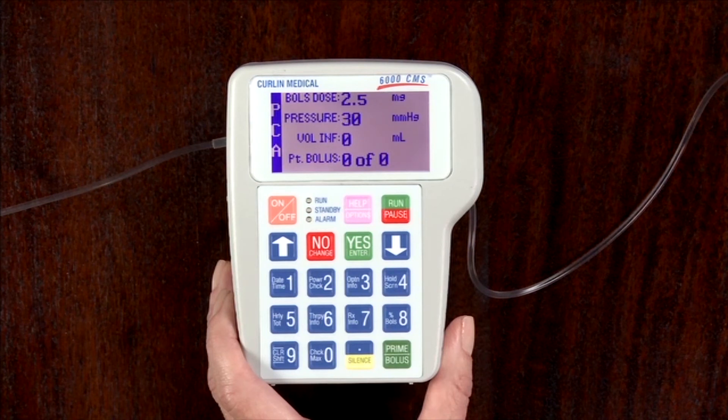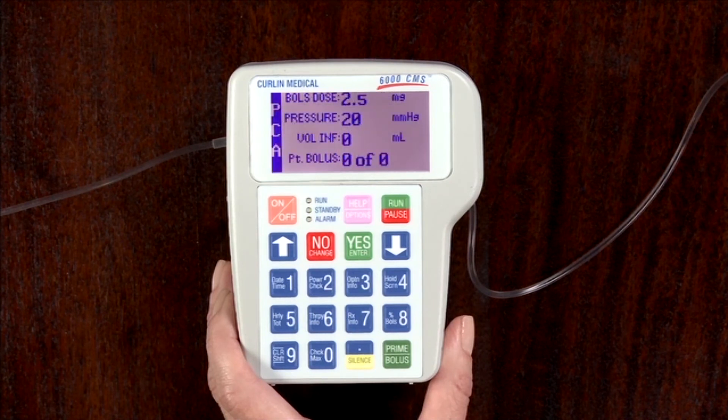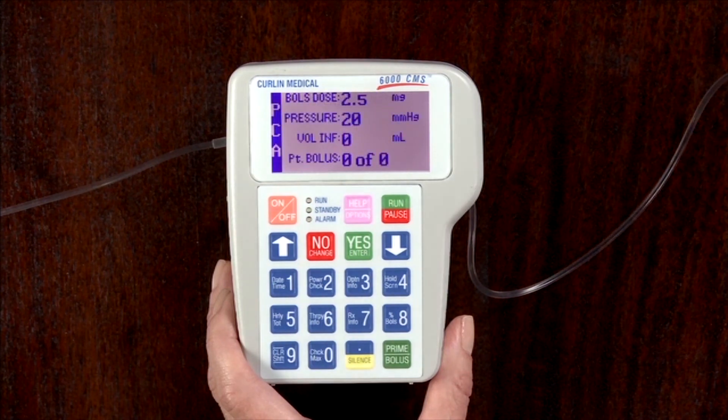The information will also include line pressures, which are listed in millimeters of mercury. Line pressures measure resistance or downstream pressure in the patient's side of the administration set and will differ for a variety of reasons including head height, catheter size, occlusions, or rate of infusion.